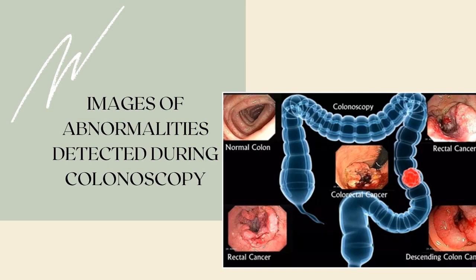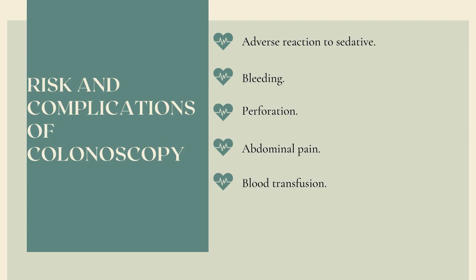Risks and complications of colonoscopy. A colonoscopy poses few risks, and rare complications of the colonoscopy may include adverse reaction to the sedative used during the exam, bleeding from the site where the tissue sample, that is biopsy, was taken, or a polyp or other abnormal tissue was removed. A tear in the colon or rectum wall, that is perforation, can occur.